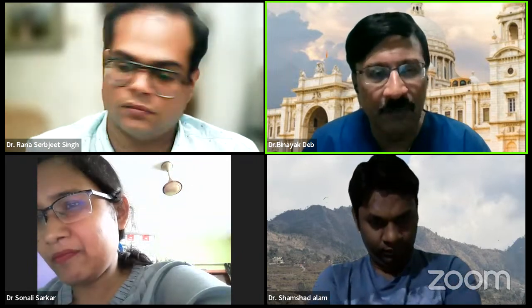But obviously, in our practice, 70 to 80 and even 90% of cases we do provisional stenting. So that is not an issue. We are really talking about 10% of cases where we have to do something. But DK crush to me is financially very, very difficult. If you have to do it properly, there are so many steps, and repeated wiring and rewiring. 7 to 8 steps you require.